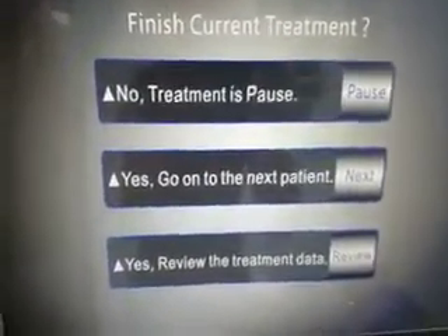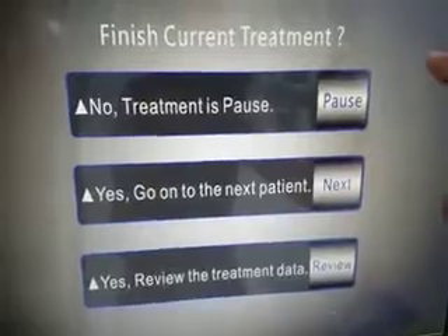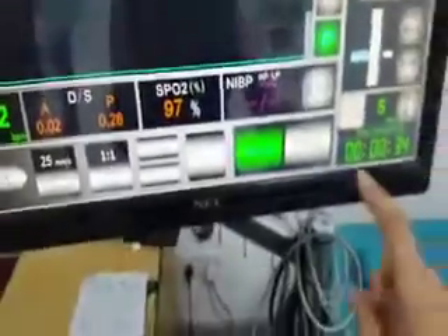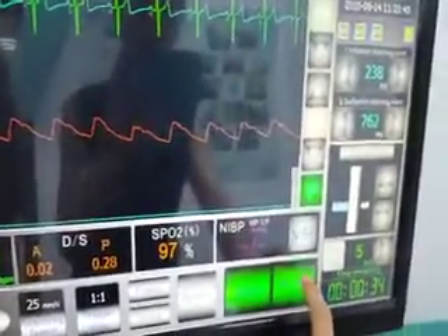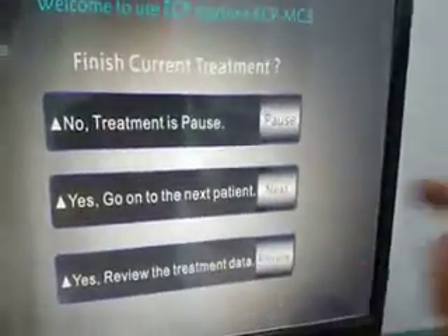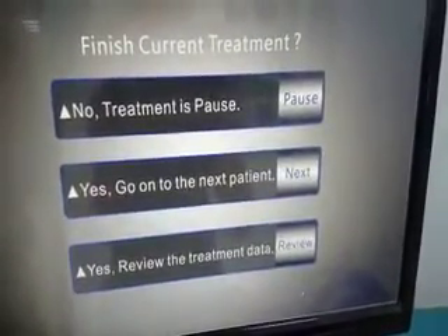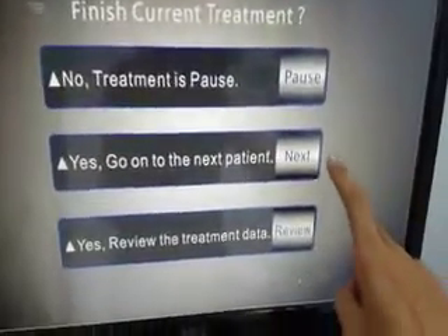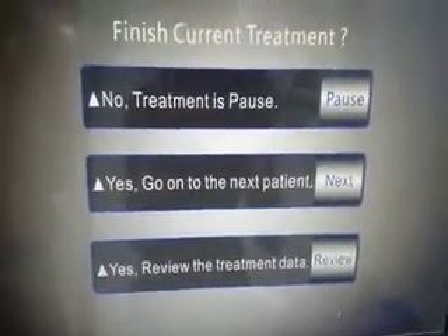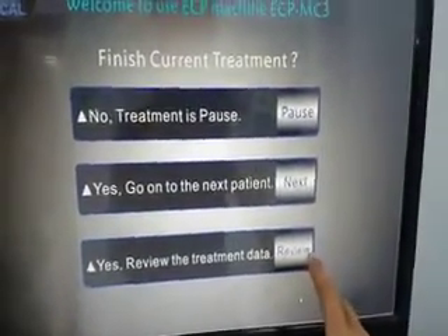If we return to continue the same patient's treatment, press pause and then press pump to continue. If this patient has finished treatment and we are changing to a new patient, select next. If you want to review the data for the patient, press review. Now we continue the treatment.